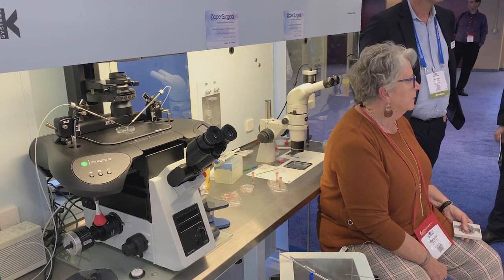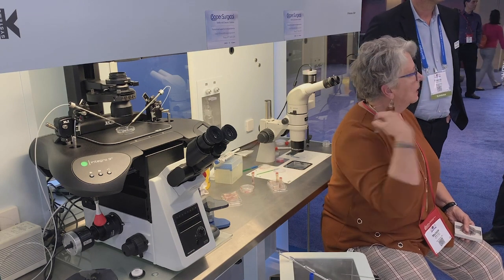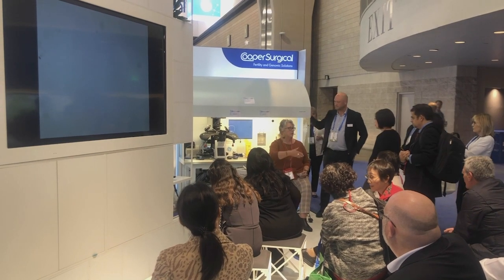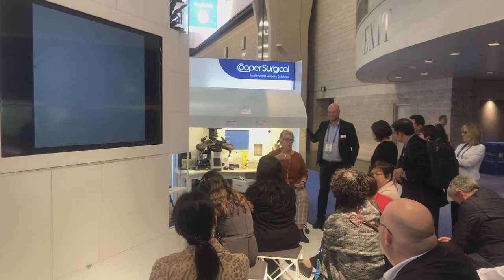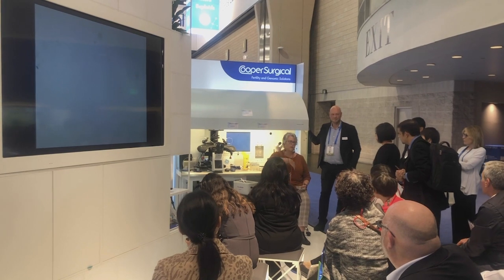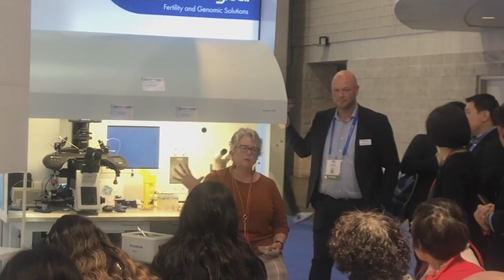37 to 38. I'm going to shoot for 38, because by the time you plunge that device, that's a cold device, into there, it's going to cool it down a little. If you start at 38, you're going to be down to 37, leave it 1 minute, and then it's just a matter of pull it up and put it into the next one. Any embryologist can pick it up from that point and follow it through, because the hard part is finding it, since it gets transparent. The hard part is making sure you've got your temperature right. Once you've mastered those, you just walk through the steps. 3 minutes in the second solution and two drops of 300 microliters each for the two final equilibrations.